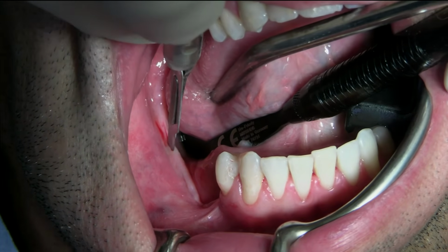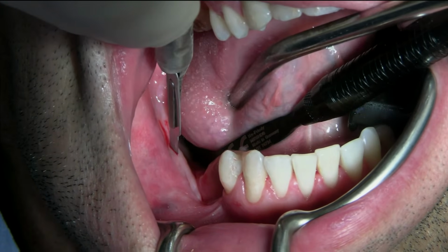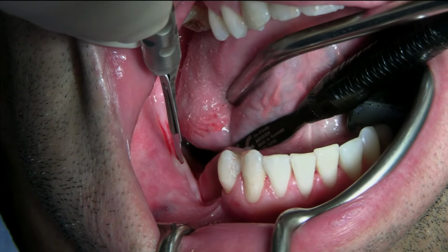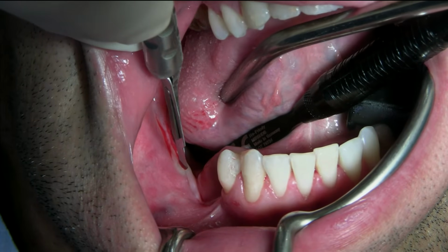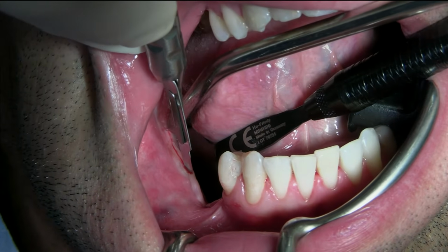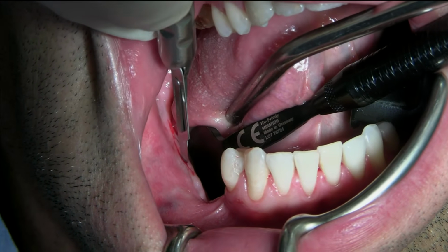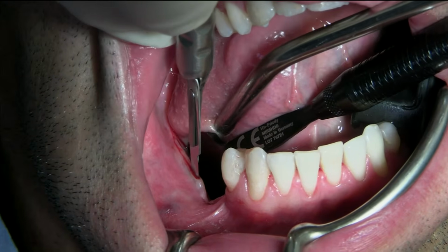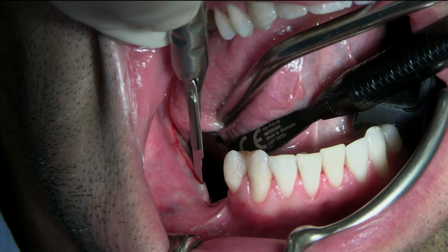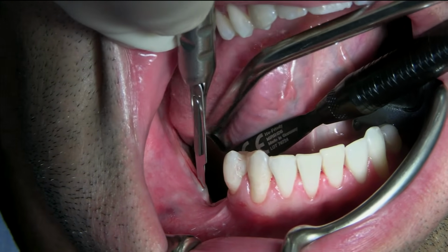Tissue is really thin here. Trying to find the keratinized tissue.